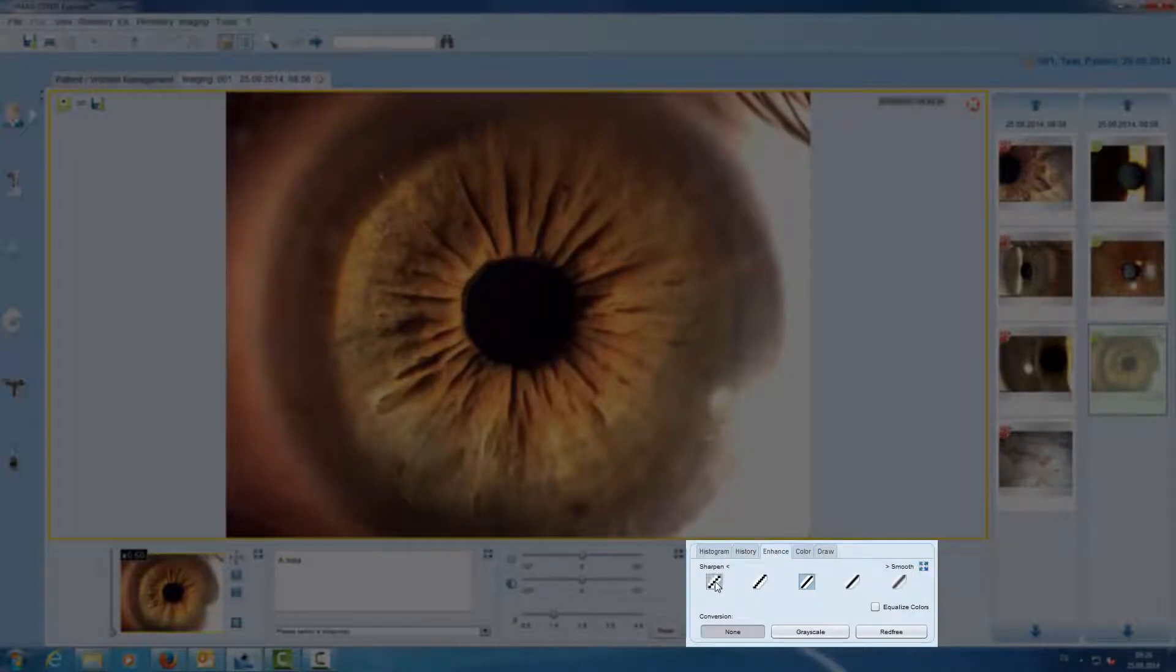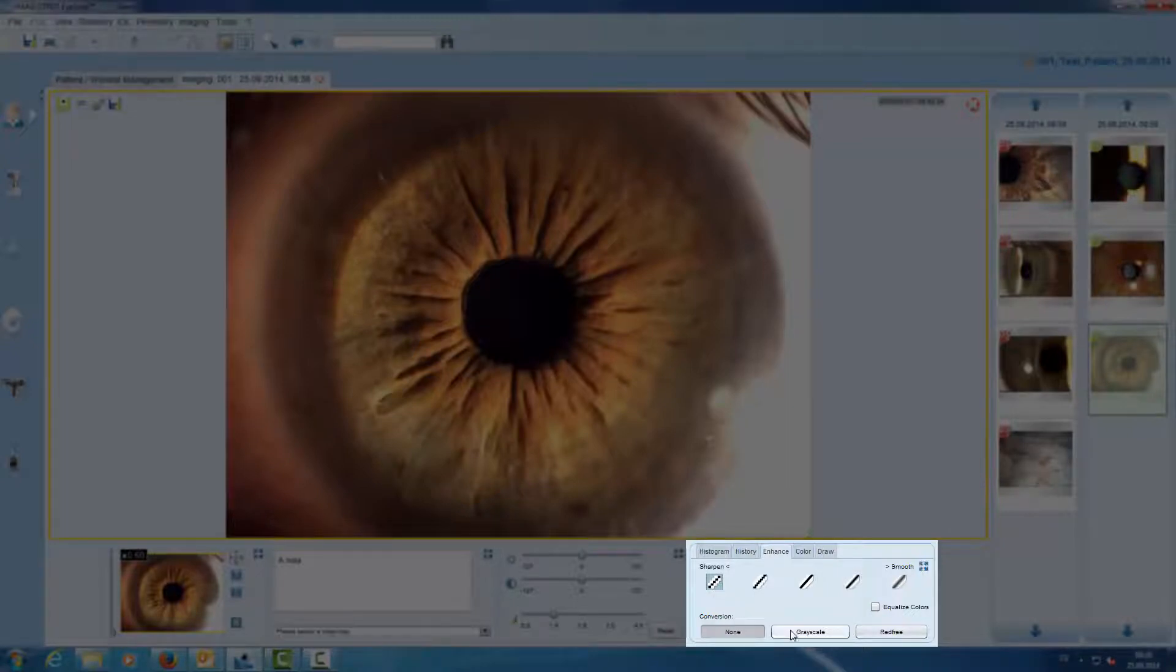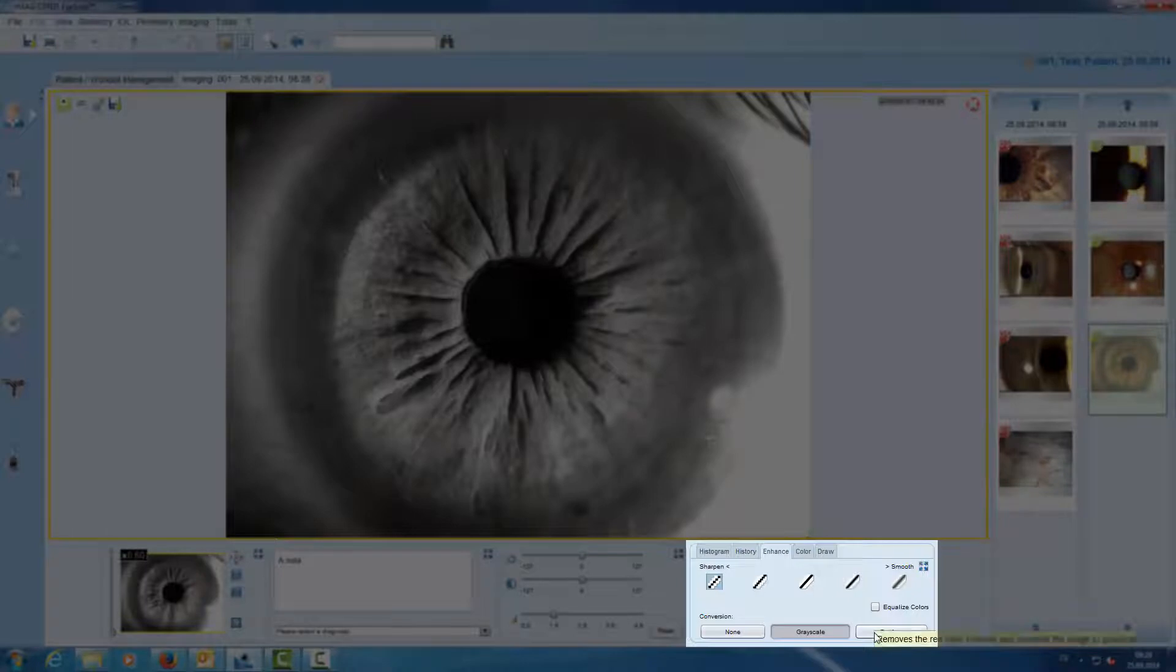With the enhanced tool we can apply different filters, sharpening filters, a grayscale filter, or a red free filter.